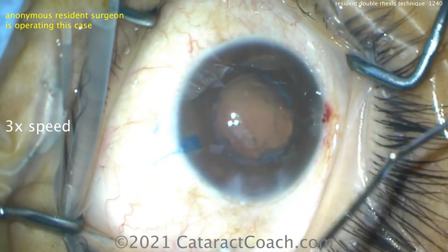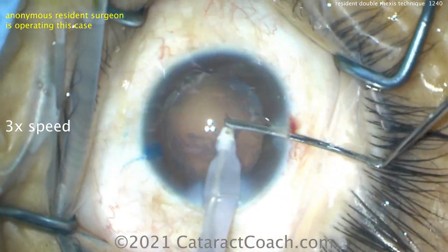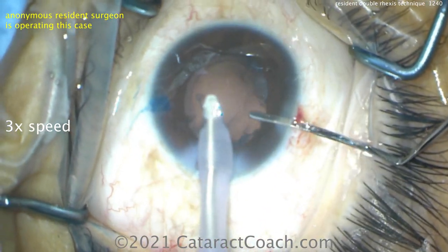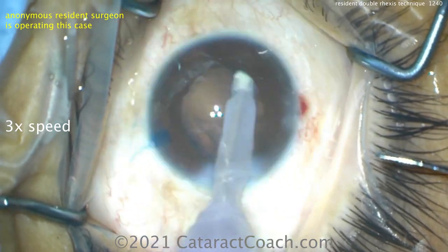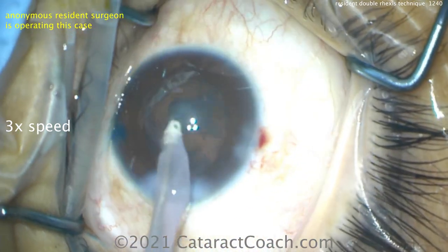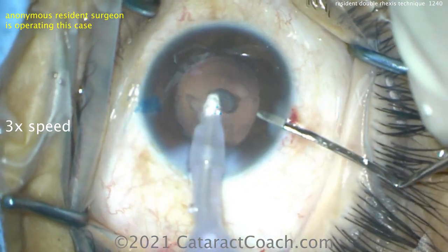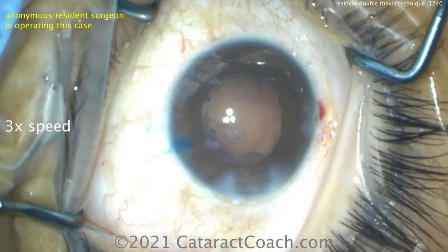We'll start to feature more videos here with audio. We just have to make sure we do that in an appropriate manner. There are actual laws that govern audio recording versus video recording — video is actually the easier one to record. And certainly all the patients featured here on CataractCoach have given their consent for videotaping the surgery.